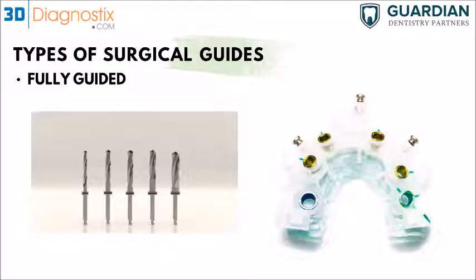So right here, as you can see, we've got those green notches or grooves on the guide, which would guide you to where to stop the timing of the implant. So just to have the internal connection, of course, set in a way that when you place in the prosthetic and the abutment, of course, it's going to be lined up perfectly the way we planned it. So this is the definition of fully guided.